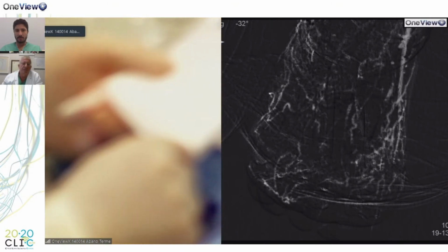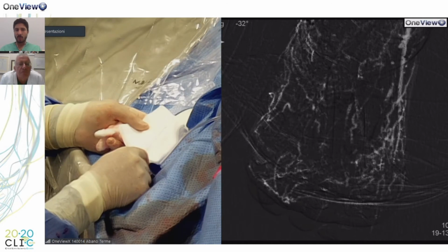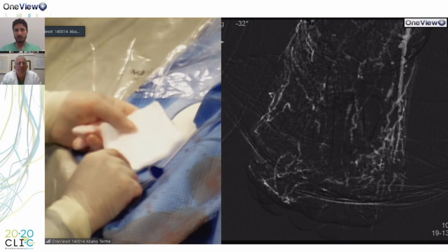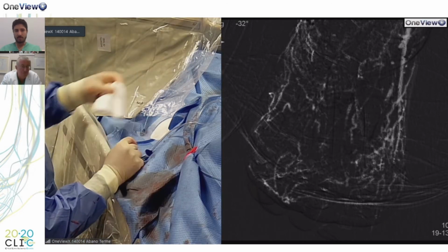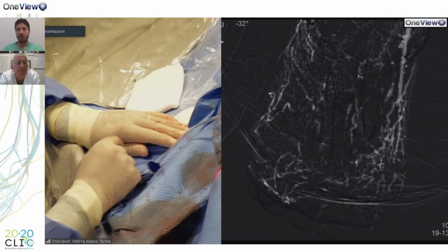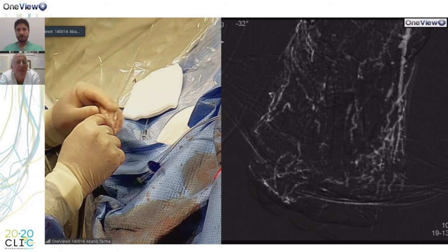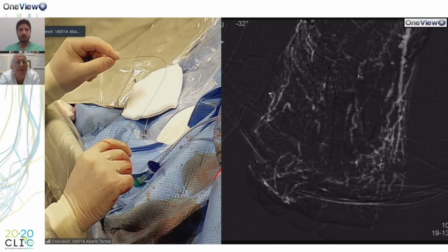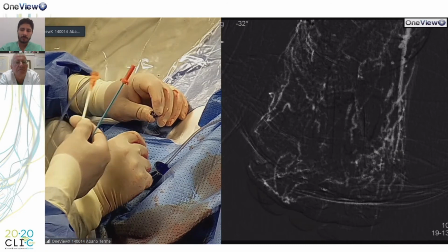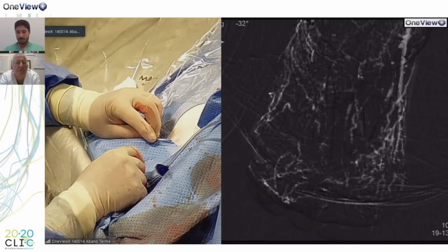This is the Throughway. The camera is not able to depict clearly the guide wire. Now you can see the tip. The tip is very, very short. Maybe on the hand is better. When the camera is so close, the image becomes not clear. Anyway, the tip is very short and very soft, and the wire is completely naked. It's a Throughway by Boston. It's not hydrophilic covered, so we will avoid any danger of damage of the wire.